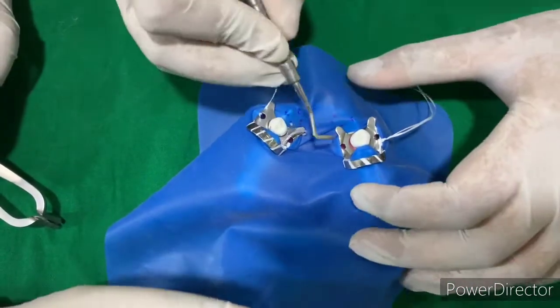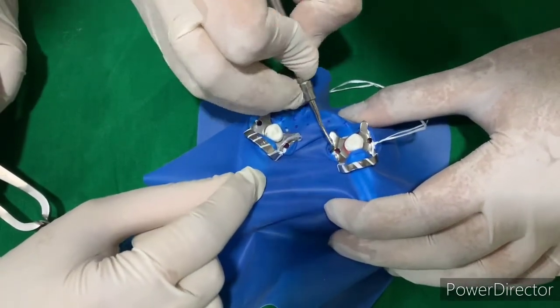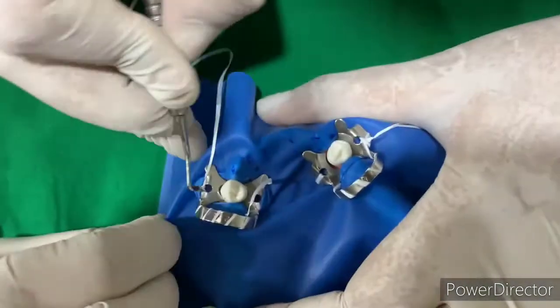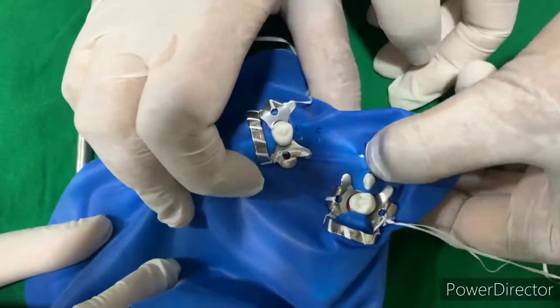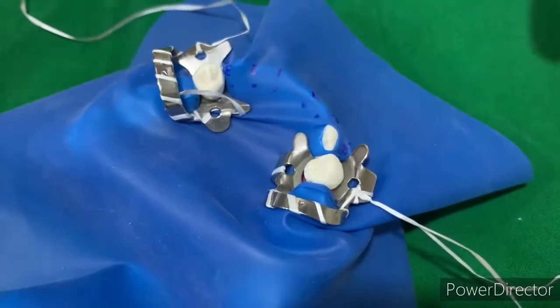Now we'll disengage the sheet from the wings of the clamp. We'll disengage the sheet from the wings of the clamp.